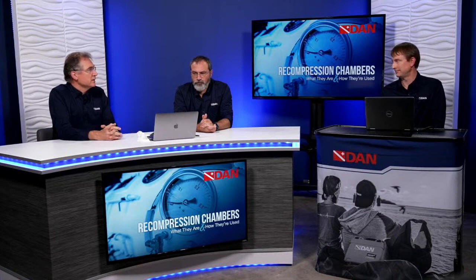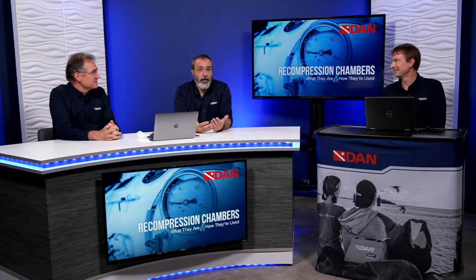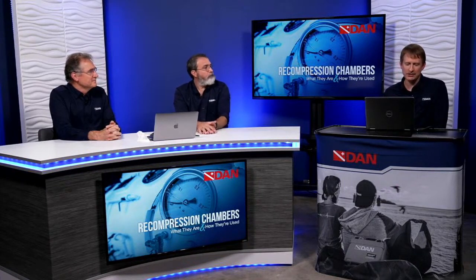The breathing rate goes down. So yes, many people will actually sleep well during the treatment. Now, your sleep will be interrupted, because they want to see how you're evolving. And many things are not just what they can see, but how you report your symptoms. So they will ask you, how is the pain going? They will need to repeat a neurological examination. So are you going to have a great night's sleep? No, but yes, you can sleep.